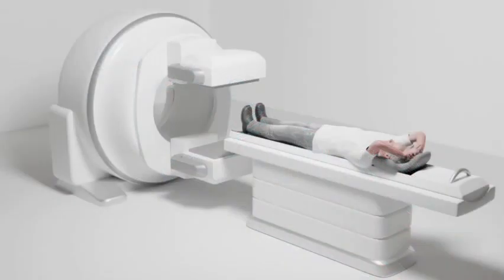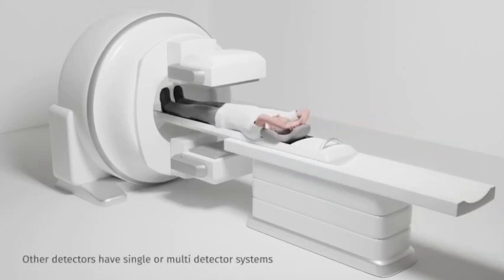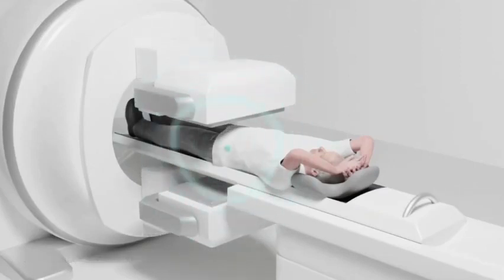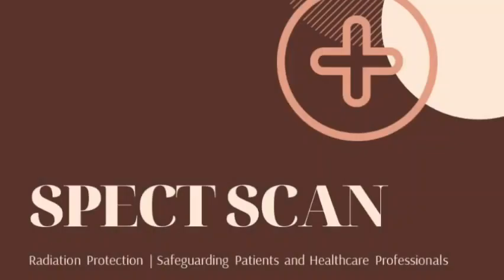For diagnostic scans, the nuclear medicine is radioactive and emits gamma rays that can be detected by the scanner. The SPECT CT machine has two gamma cameras that detect gamma rays and produce a map of how the tracer is behaving. These detectors rotate around the body, taking images every few degrees, allowing images to be reconstructed in 3 dimensions.